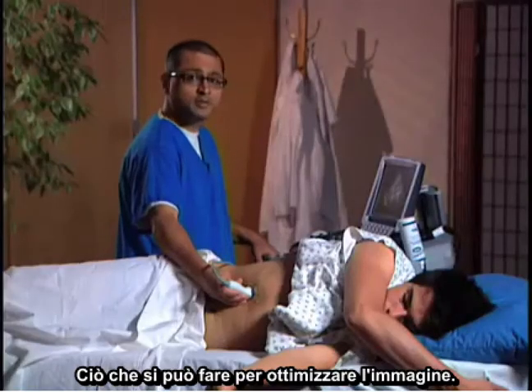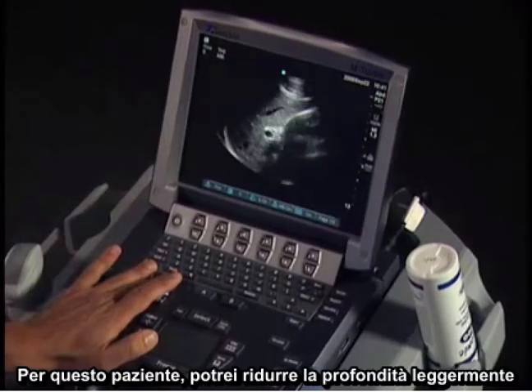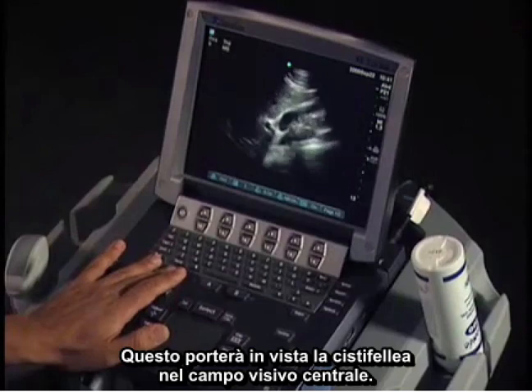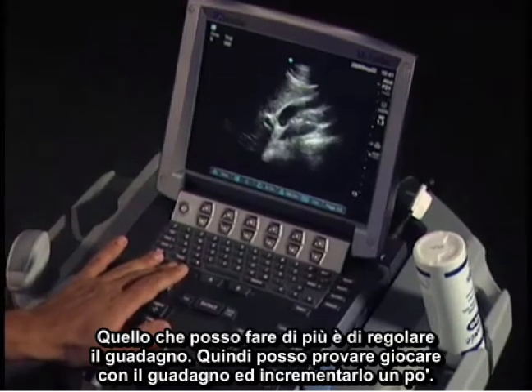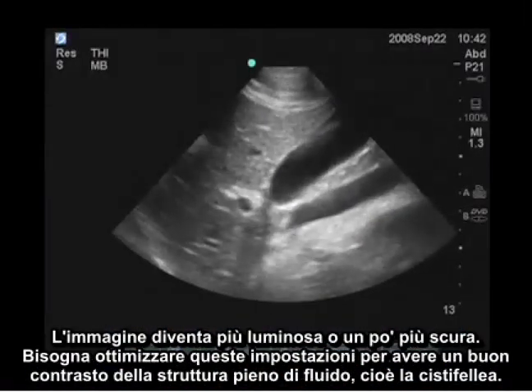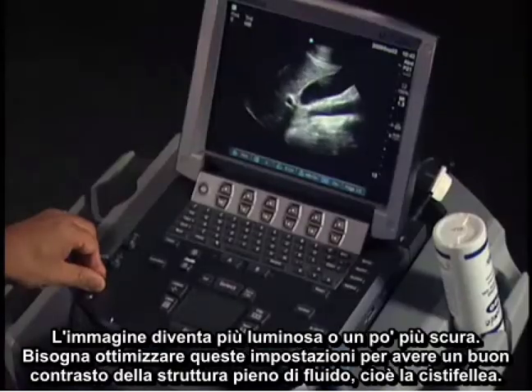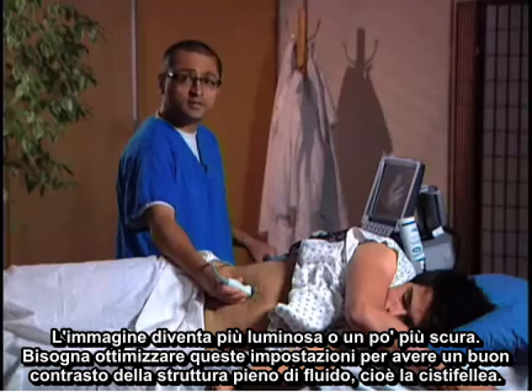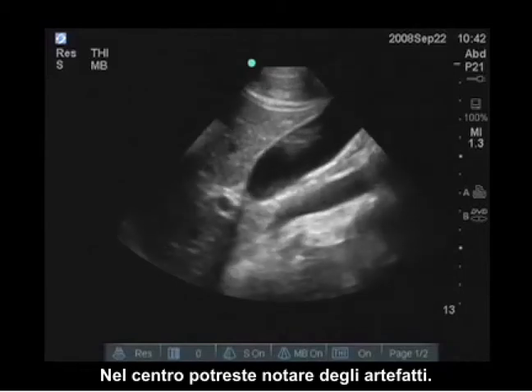There are things you can do to optimize the image. First, you can change your depth — in this gentleman I may decrease the depth slightly to bring the gallbladder better into the mid-center field of view. The other thing I can do is adjust the gain slightly. You can see the image gets brighter or lower. You want to optimize these settings so you have good contrast of the fluid-filled structure, which is the gallbladder, and you can also notice any artifacts.